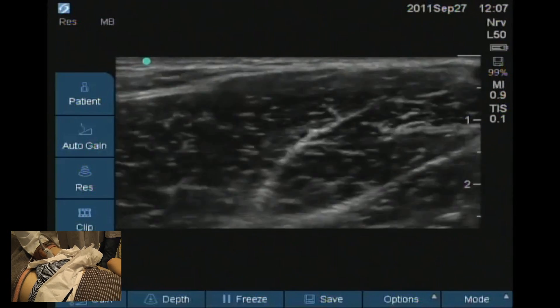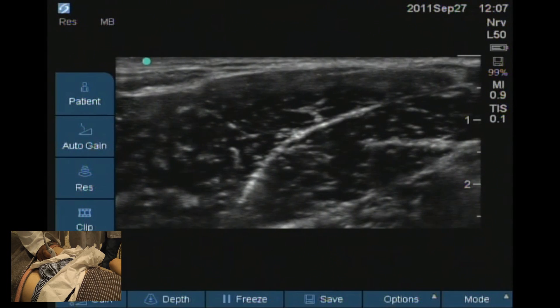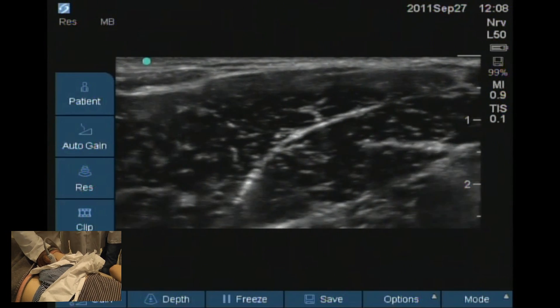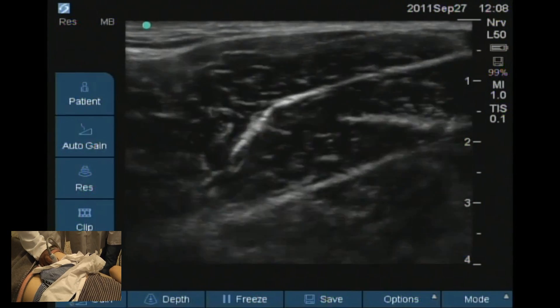And then if you go further medially, you see the three adductor muscles: adductor longus, adductor brevis, and adductor magnus. Now, because these muscles are big and chunky, we need to increase the depth so we can see them clearly.